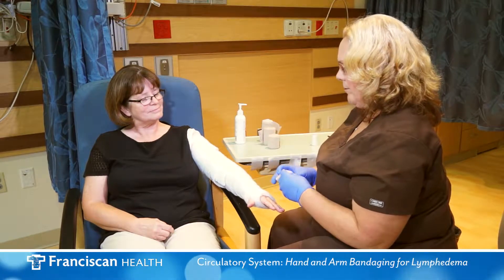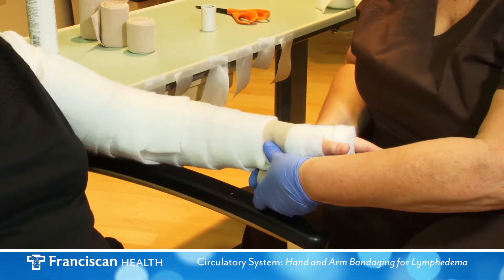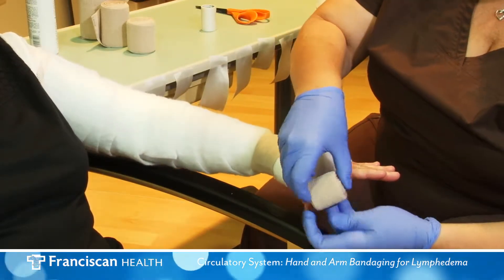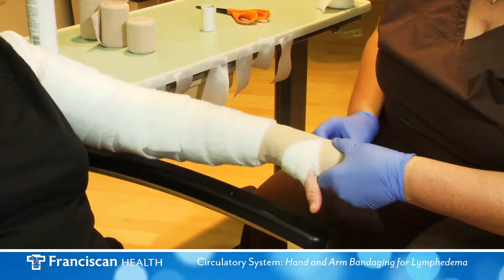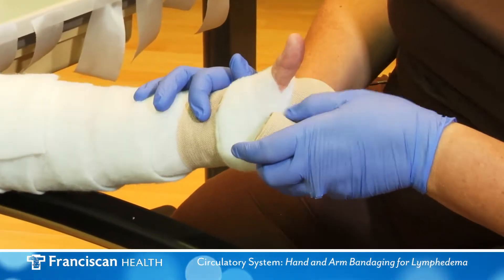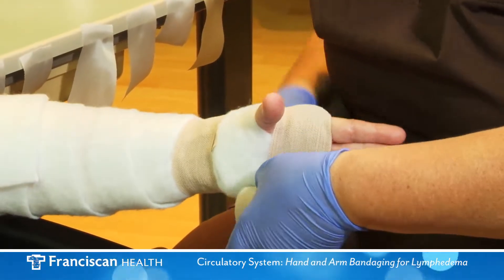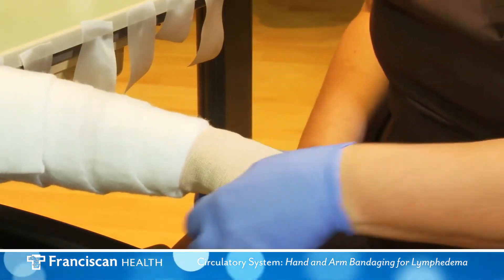Next you will apply the short stretch brown bandage. You will use various sizes. Begin with the smallest at the wrist. Use moderate tension covering all of the hand including the knuckles. You will use a number of layers applying bandages from the knuckles to the wrist. Keep the fingers open and extended while wrapping the hand.